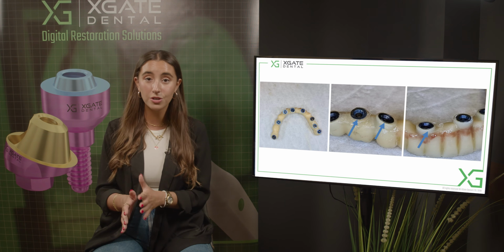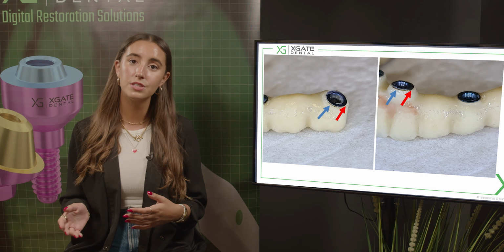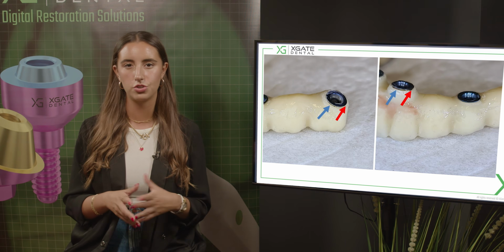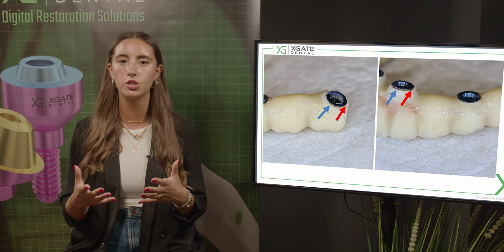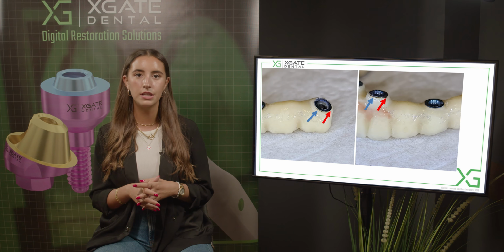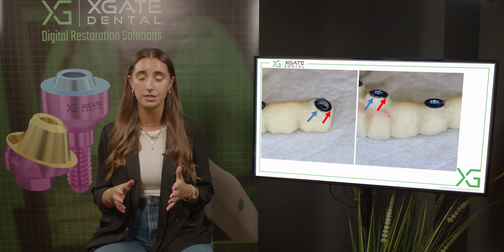And then after 1 to 3 days, maybe a couple of weeks, the zirconia will just crack. And then you'll see 2 parts of the zirconia. One is higher than the other. And here you see that you have a very small slot between the sleeve and the zirconia bridge. Right now, you can take flowable liquid composite material, just close it up and polish it. So we just added some material here to close it, and this way you don't have any gaps for bacteria or different types of organisms.